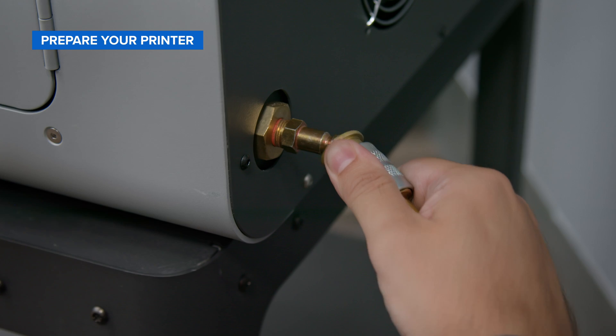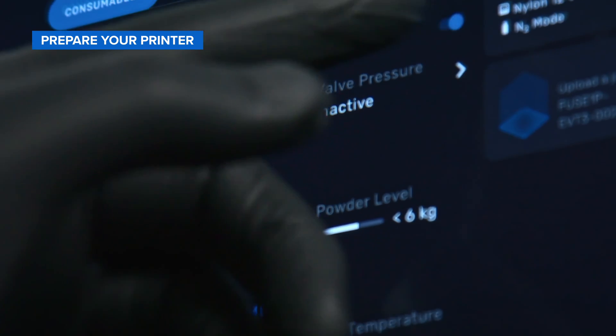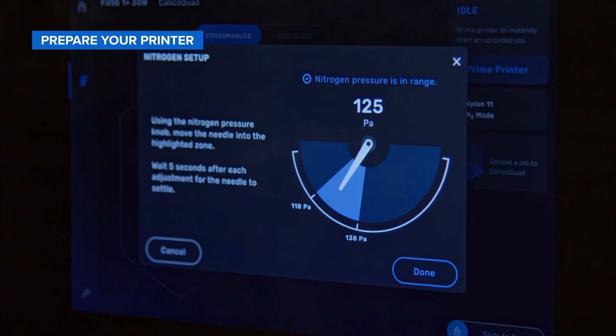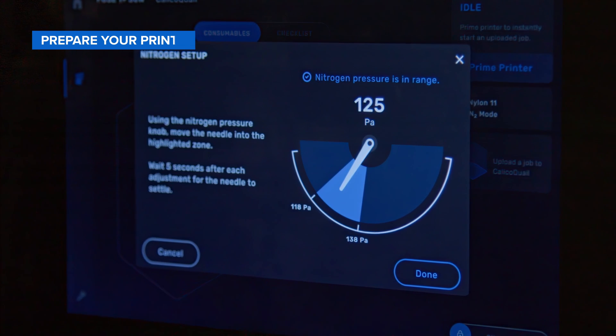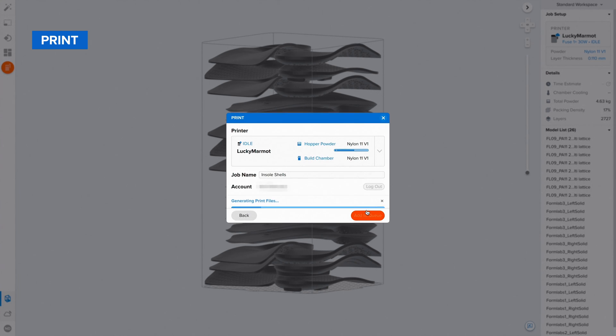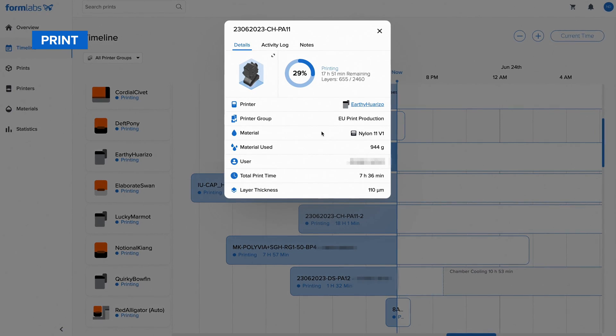Connect the nitrogen supply to the nitrogen interface at the back of the printer. Simply check your touchscreen to ensure the printer is set to N2 mode and that the inlet and valve pressures are in range. Once your printer and nitrogen system are ready, return to Preform and simply press print to send your design to the printer. You'll be able to monitor your print from anywhere using Formlabs Dashboard — no babysitting required.